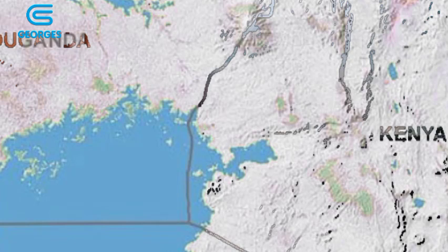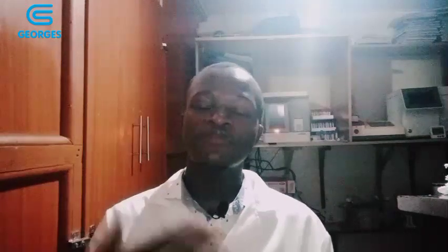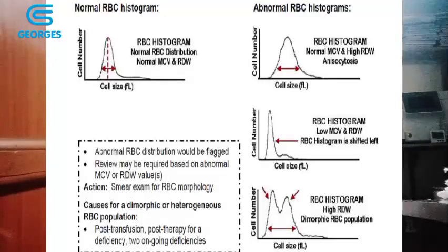So when there is an increased number of mosquitoes, it therefore means that the prevalence of malaria infection will be higher. So at the end of every full hemogram report, there are always some cell histograms. These cell histograms are actually some graphs that show the cell size and the cell number.